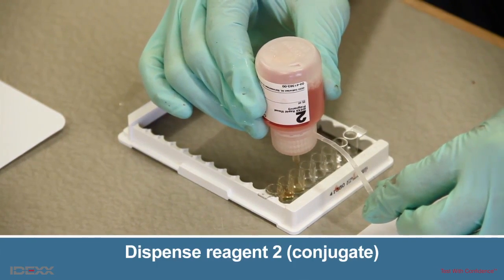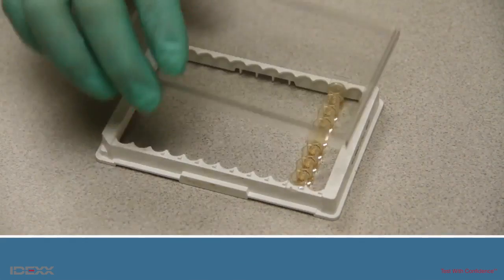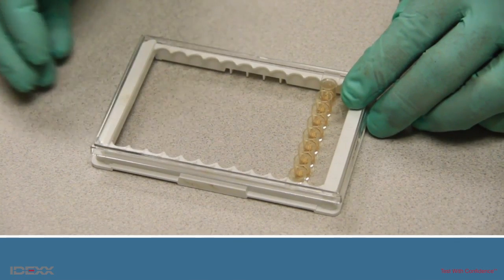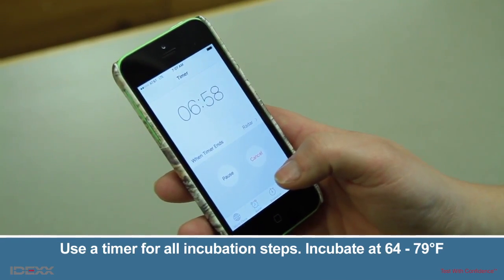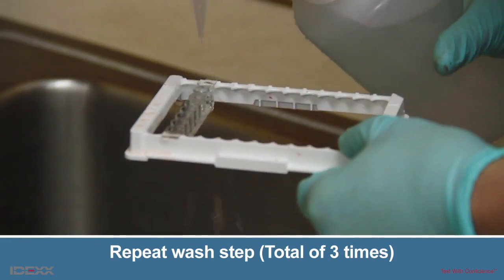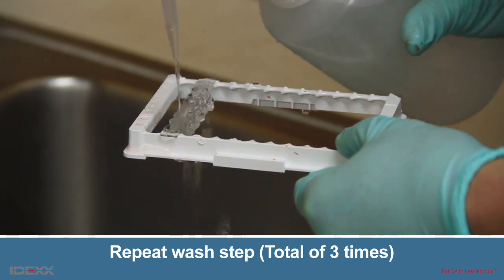Dispense three drops of Reagent 2 into each well. Cover the wells with the plate cover and gently tap the plate 10 times to mix. Start the timer and incubate the plate for seven minutes at 64 to 79 degrees Fahrenheit. After the seven minutes of incubation, repeat the wash step performed earlier for a total of three washes.